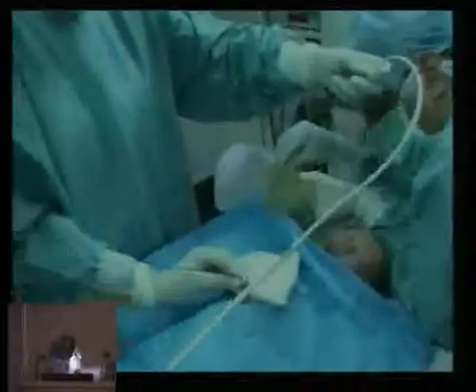This is the PEG tube. This is the plastic tube. This is the knot we put. It is like 2 ends with dead ends. So if you pull it, that's the knot, right? Having done the knot, now when I pull from here and put it from the mouth, obviously that thing is going to enter and come out. You've got to give just the right incision, making sure that it's neither too small nor too big. Otherwise, it's going to come out.